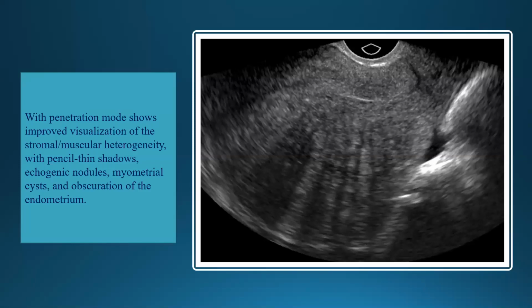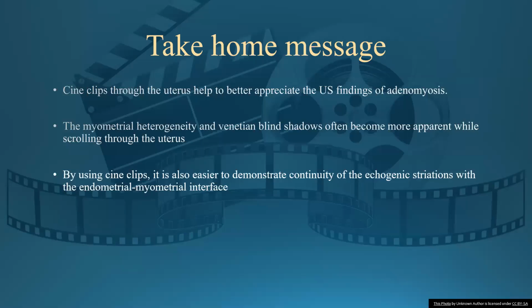So take home message for this part, it's better to use cine clips through the uterus to better appreciate the ultrasound findings of adenomyosis. So for my colleagues all over the world, if you want a consultation on an ultrasound image about adenomyosis or any other topic, you want to send it to another colleague, send the cine clip. Don't send just a photo or a picture of what you're seeing, because I'm going to show you some video clips demonstrating how much clearer it is when we use the cine clips.